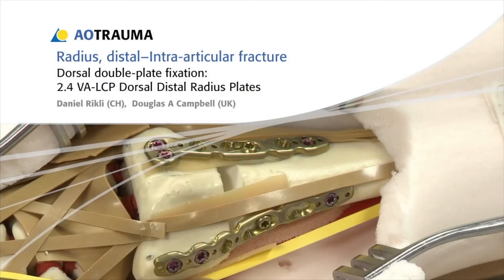In this presentation, an intra-articular fracture of the distal radius will be treated with dorsal double plate fixation using 2.4 variable angle LCP dorsal distal radius plates.